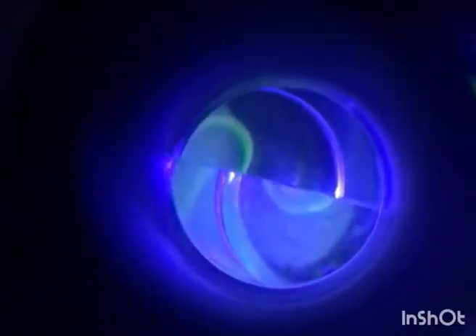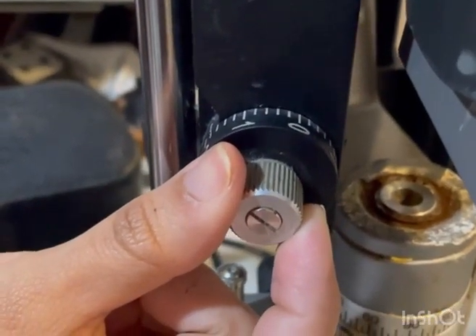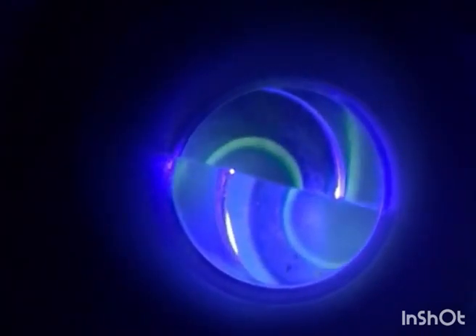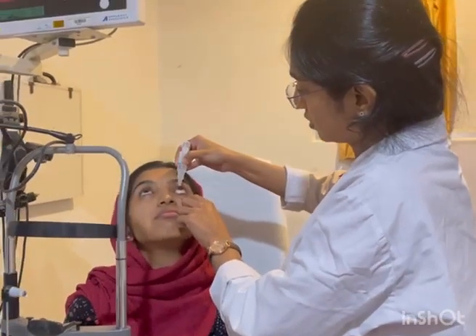The fluorescent semicircles viewed through the prism and forced against the cornea should be adjusted until the inner edges overlap. Repeat the same procedure for the other eye. After taking measurements of both eyes, apply antibiotic eye drops at the end in both eyes.